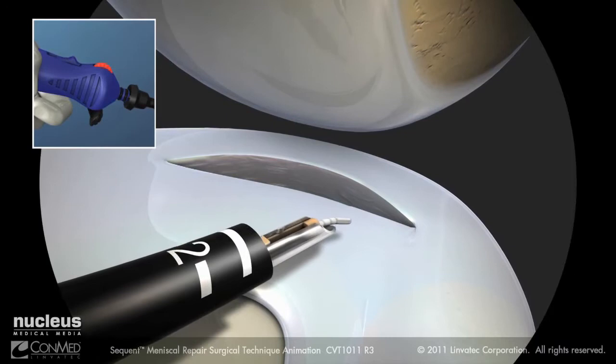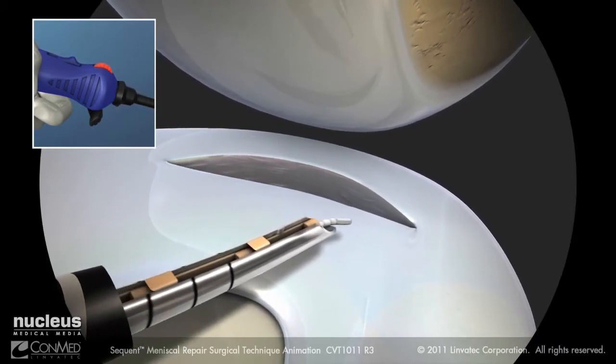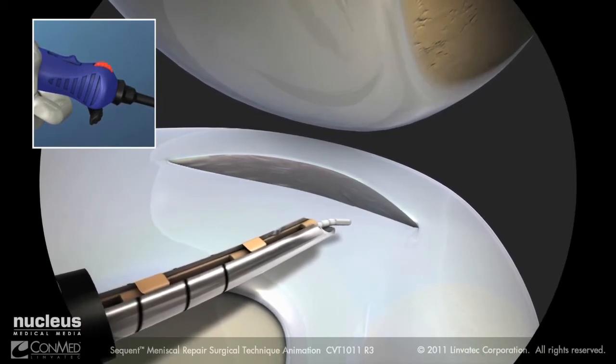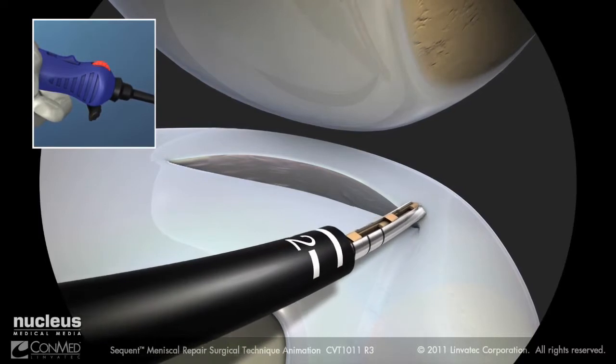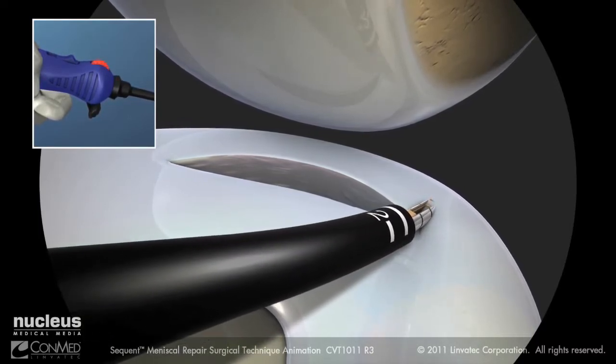Pull back on the depth stop sheath until it engages fully onto the handle. Ensure that the switch is forward in the freewheel position and pierce through the meniscus. Use the needle markings to ensure the proper depth of penetration.